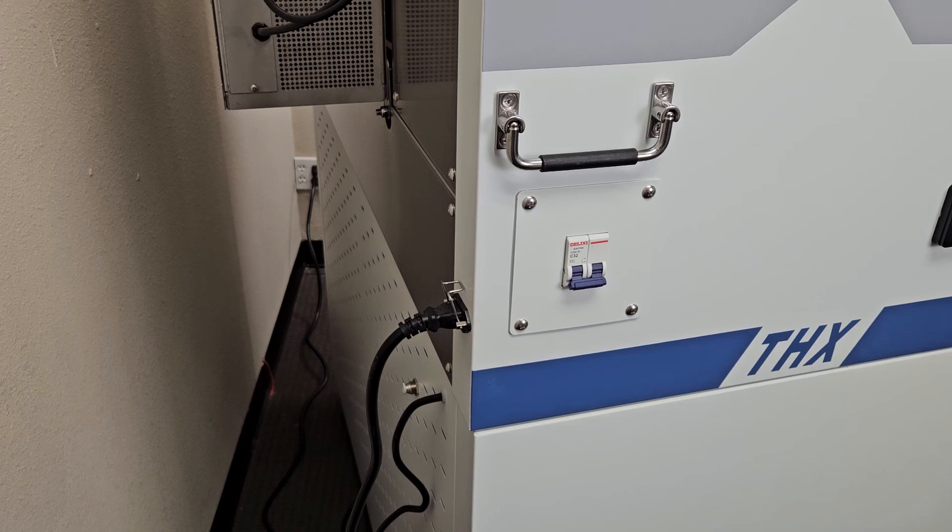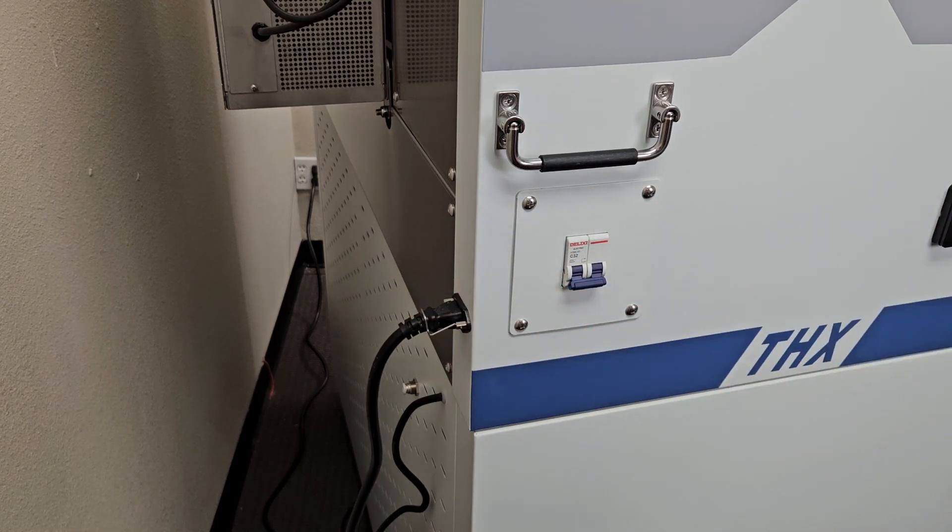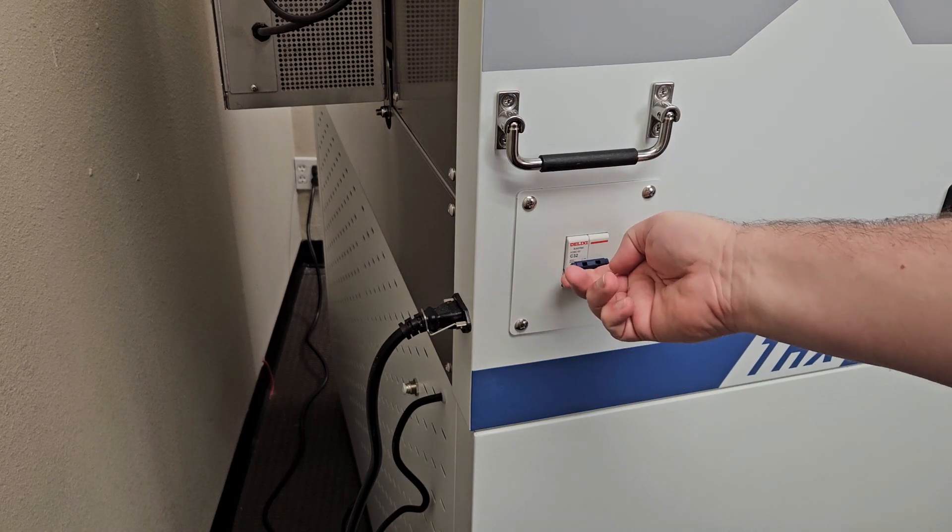To begin, ensure that the power cord in the rear of the unit is plugged into wall power. You can secure the plug using a metal clip to prevent it from being accidentally removed. Ensure that the circuit breaker on the side of the unit is flipped up to the on position.